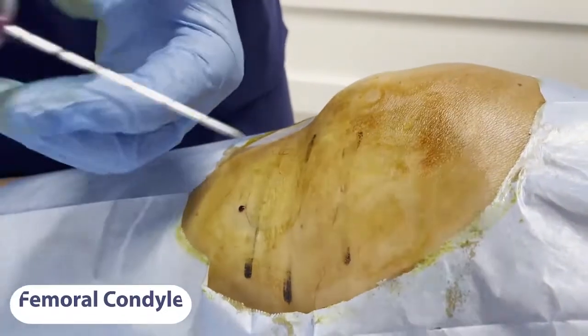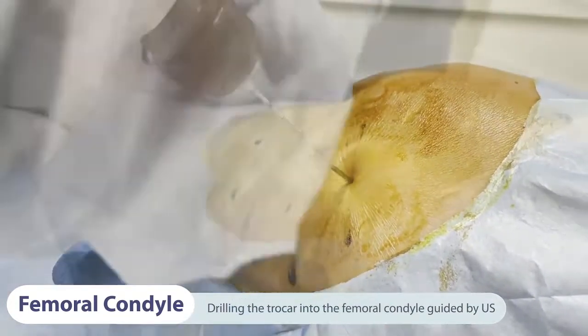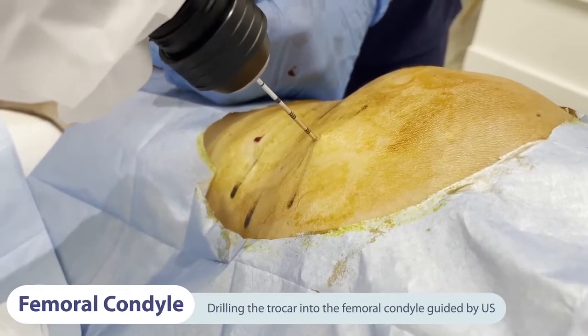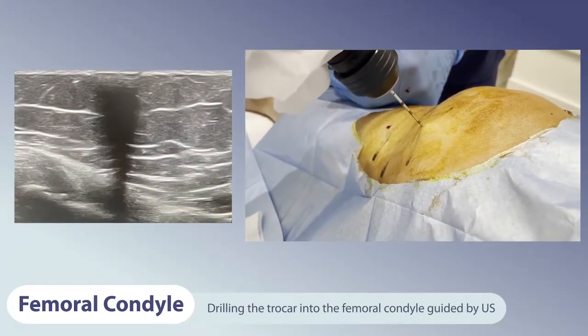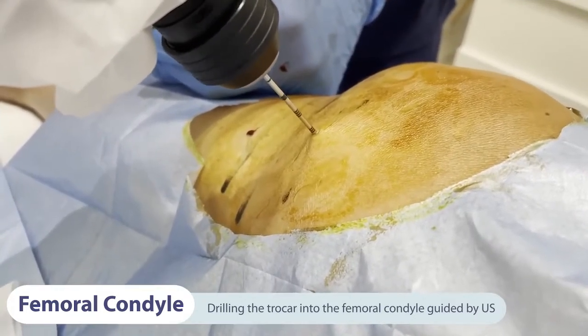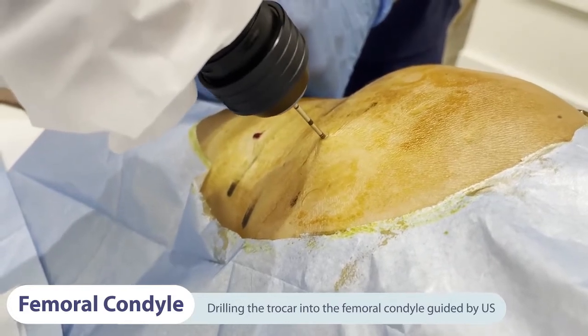The next step is to proceed with intraosseous infiltration of PRGF into the femoral condyle. The efficacy of the anesthesia has already been observed previously, so we can proceed to place the tip of the trocar biopsy needle system at the entry mark point, 2 cm proximal to the articular line with an inclination of 30 degrees. We then advance the trocar 1.5 cm deep into the subchondral femoral bone using the ultrasound image.